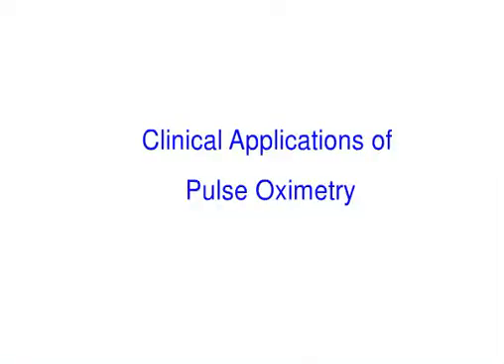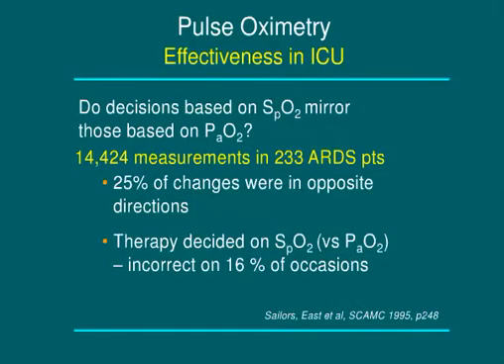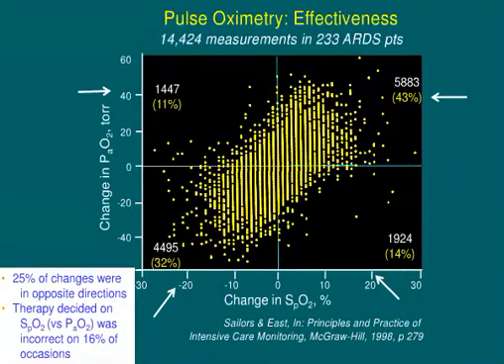So what are some of the clinical applications other than obviously the detection of hypoxemia? Well, this was a study that was done by Tom East from Alan Morris's group, and what they wanted to answer in this study is, do decisions based on SpO2 mirror those based on the PaO2? Here you'll see the changes in PO2 versus the changes in SpO2.